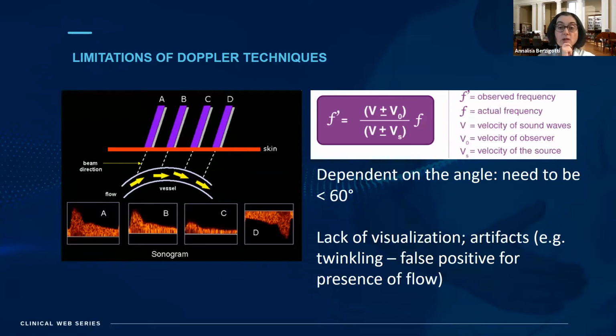So we all know that if a vessel is basically at 90 degrees to our visualization, the probe and our sampling position, we will have a lack of visualization of signal, or we can have other problems like artifacts, like the twinkling artifact if we are hitting a structure which has a very different reflectability in comparison to the remaining part. So we can have false positives in this part, or we can have false negatives for flow. So we should solve this problem.